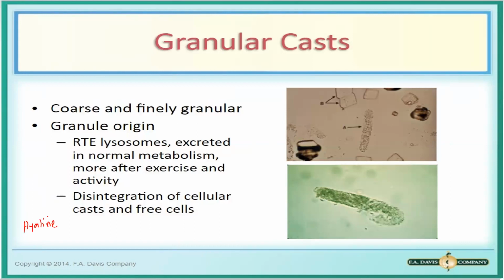cast. Okay? If in cases na merong cells within the dumaan sa tubule, so matatap sila, magiging cellular cast na siya. When I mean by cellular, it could be RBC cast, it could be WBC cast, it could be epithelial cell cast. Okay, cellular cast yung mga yun. Yung cellular cast, further urine stasis, nagsa-start na mag-degrade yung inyong mga cells. Okay, it becomes coarse granular.